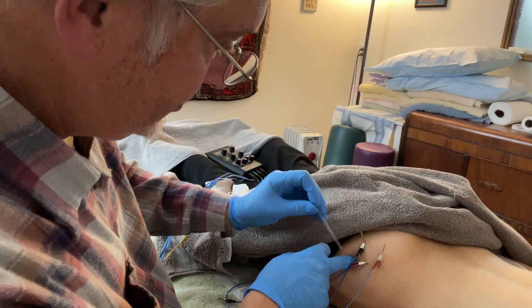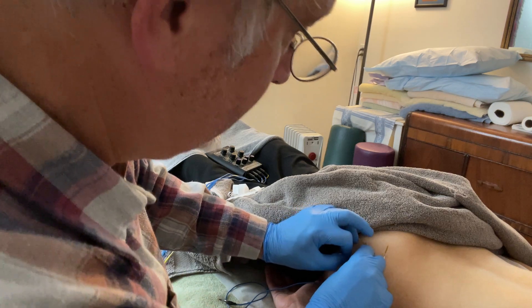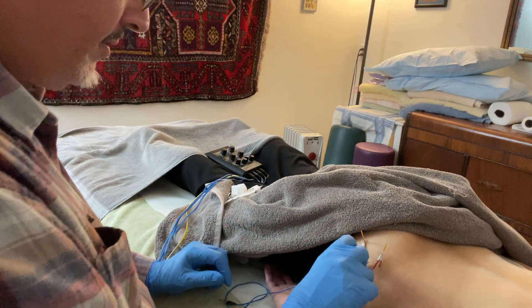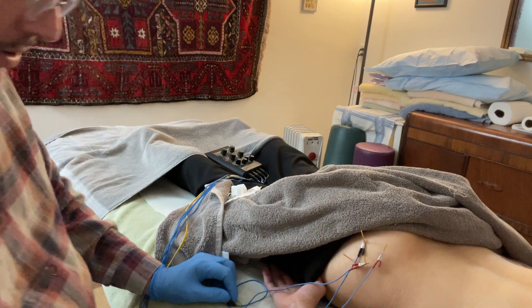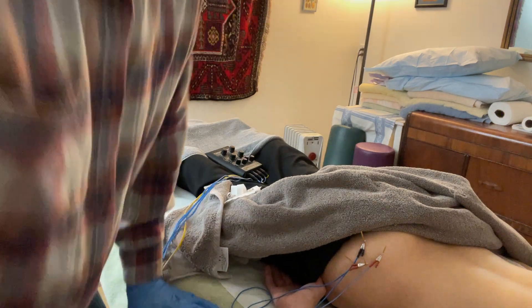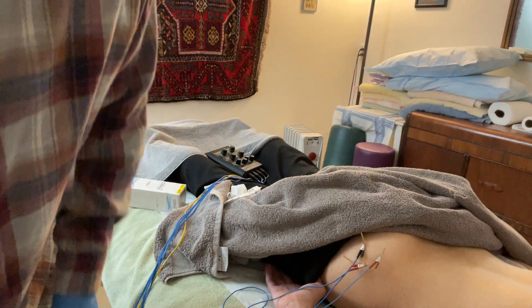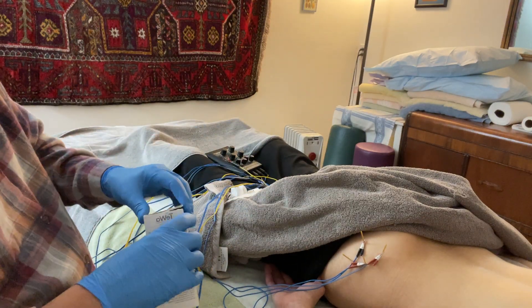I need one more point to attach that one to, so we're going to go here. It's kind of an awkward angle for me. Even deeper — let me get a longer needle there. She's not by any means overweight, but she's got really developed muscles because of her athletics. I have three-inch needles, which is longer than that one, so let's go in with the three-inch.